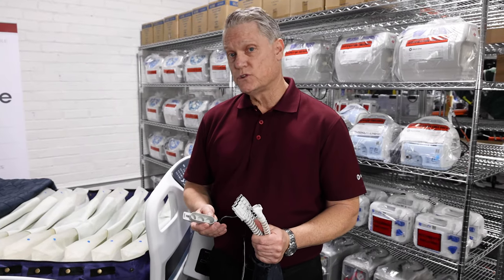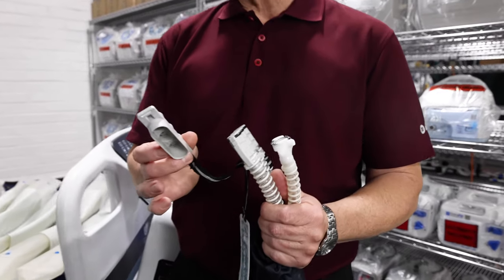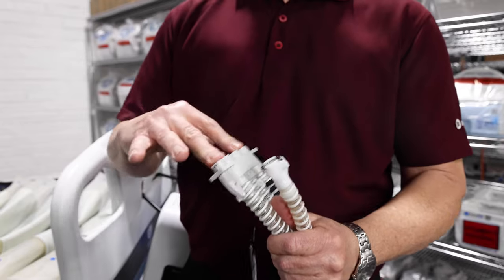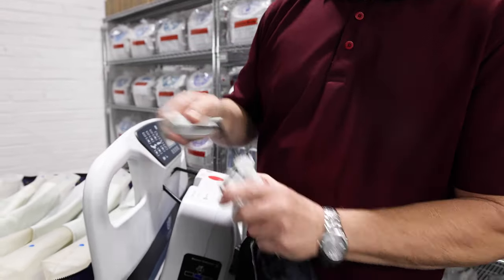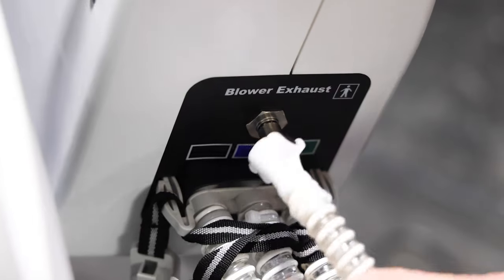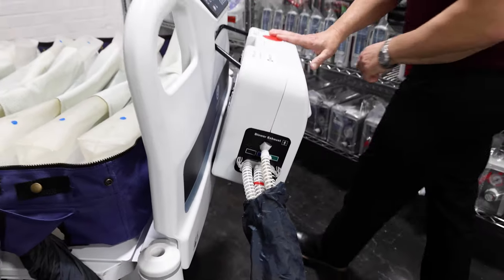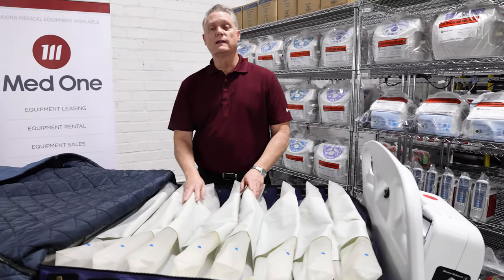And now let's connect the mattress to the control unit. You'll notice there's a hose cap. During a patient transport, you'll want to cover your hoses with this cap to seal in the air during that transport. Now let's go ahead and move over and connect this to the unit. You simply want to push in a firm push in. You might hear a click or a snap to ensure it is properly installed. Turn your mattress on. You'll notice that the mattress begins to quickly fill up with air.